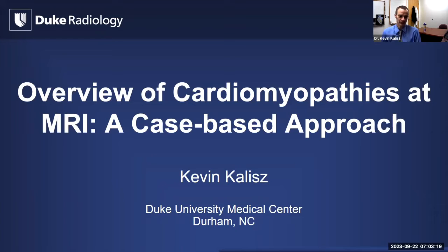So as Mohammed said, I'll be talking about an overview of cardiomyopathies at MRI. It's titled here a case-based approach, and that's really what this is intended to be. It'll just be a lot of illustrative cases.